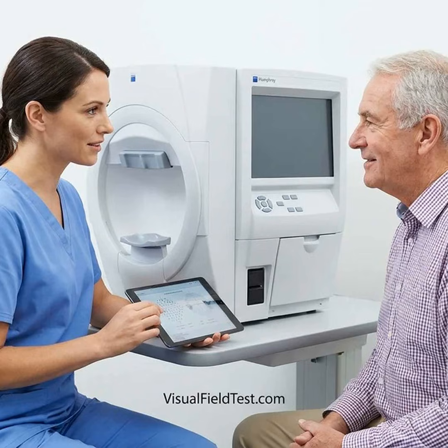For most patients, a short demonstration or practice block is preferable to repeatedly performing a complete clinical test before the actual measurement. Combined video and verbal instruction. Video appears to work best when it reinforces, rather than replaces, a clear explanation from the technician.